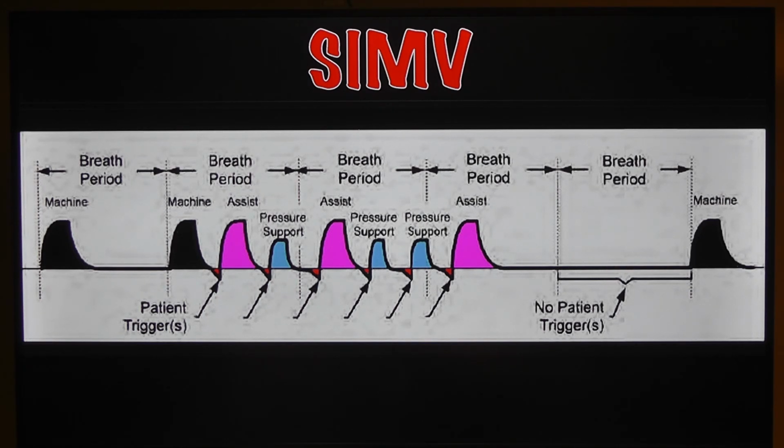If you were to turn the pressure support up to the same pressure that was required to deliver your AC breaths, it would be the same. And we'll look at this on the ventilator here in a second to make a little more sense. So now we break that breath barrier. Notice how we did not get a machine breath as soon as we kicked over. The ventilator said, this is where that synchronization piece comes in. The ventilator says, hold on, you were trying to do some work, so I'm going to let you.